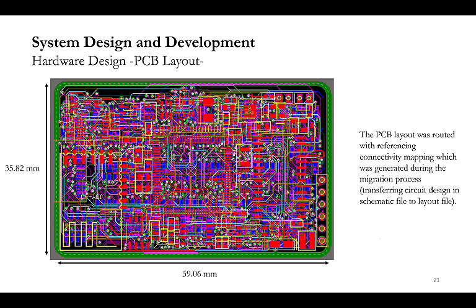What microcontrollers are you using? STM32. It is an ARM Cortex M7 microcontroller. I was thinking there are some cheaper Chinese versions you can use, right? They sell pretty cheap ones.